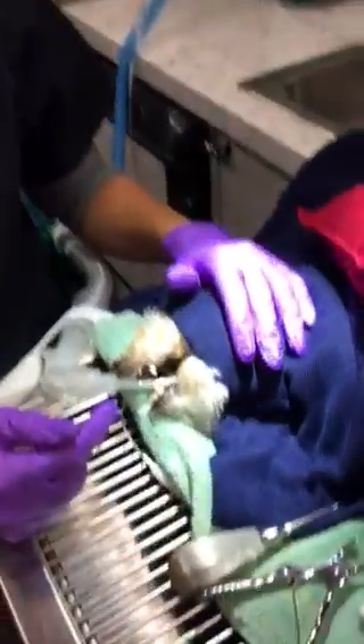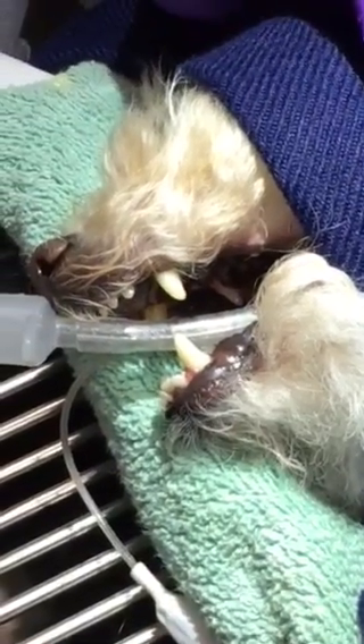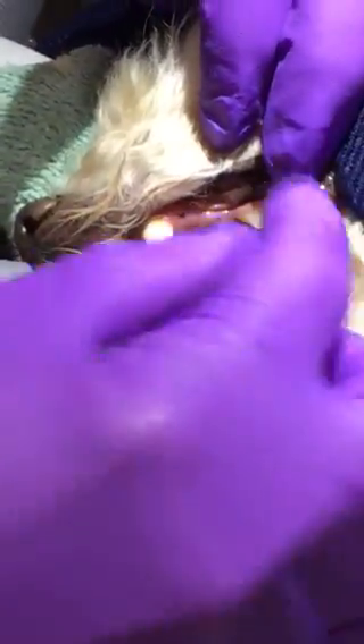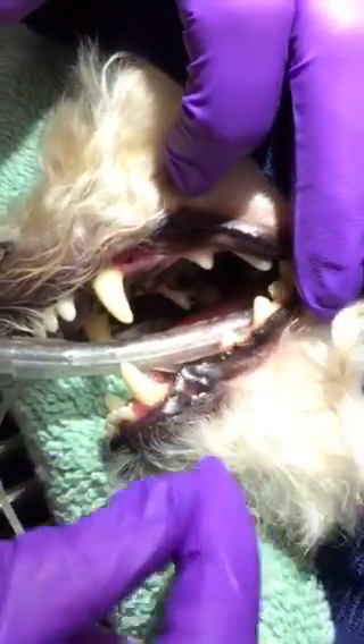This little one under here is Mim. She's under a lot of monitoring equipment and heat right now so you can't really see her, but we're going to be focusing on her teeth. These teeth have been pre-cleaned, which is really important when we're doing extractions. You can see a little bit of blood here just from the cleaning, just as you would for a human dental cleaning.